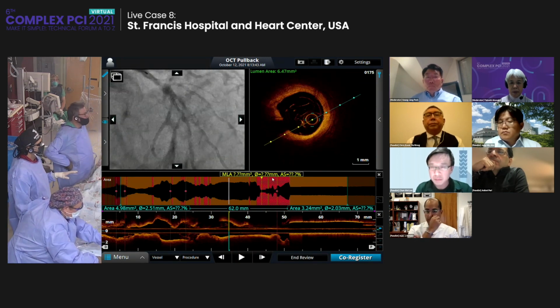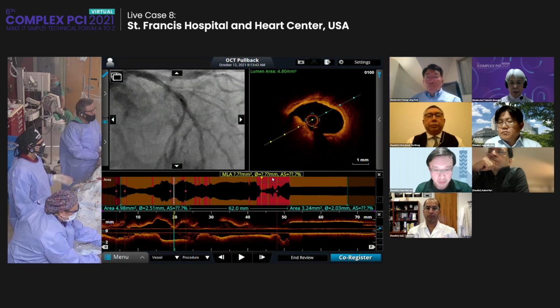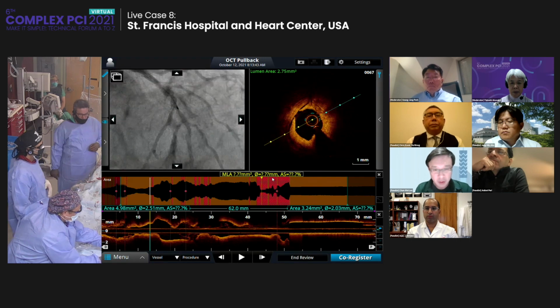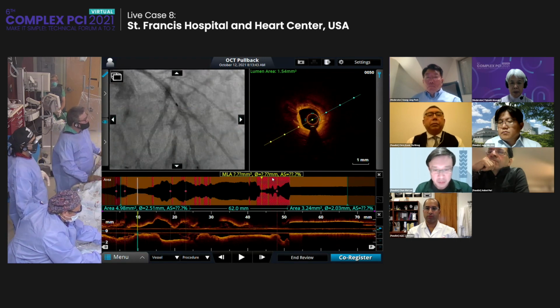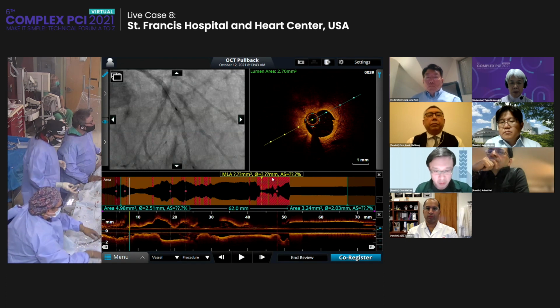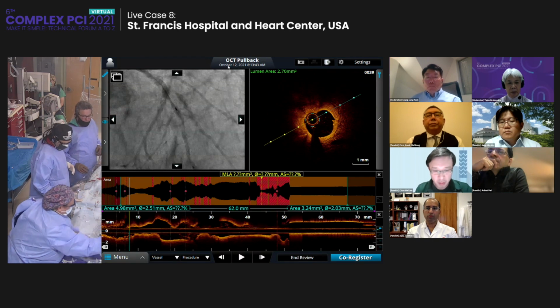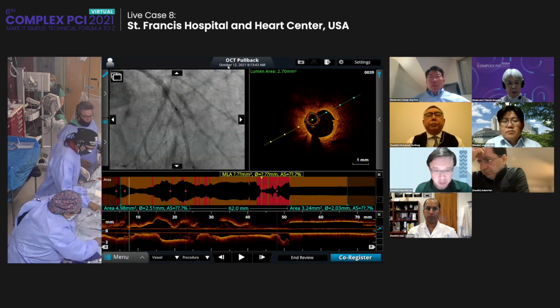So there's really not much more to do with this OCT. We won't overanalyze it because we're going to go back with our balloon. And in case we can't deliver the balloon because we haven't adequately prepared the lesion, we'll get another balloon. The point being is that we're going to know what we're dealing with before we stent the vessel.